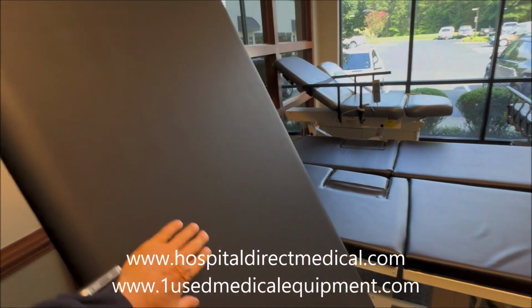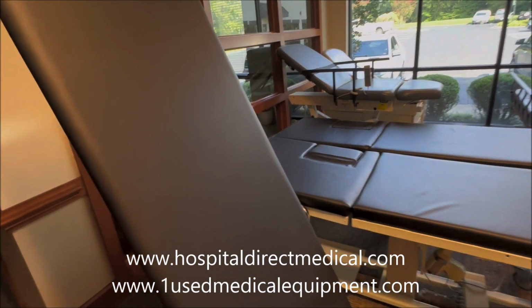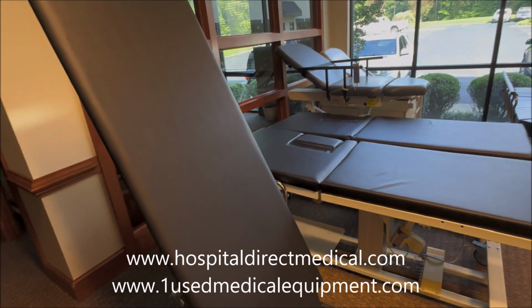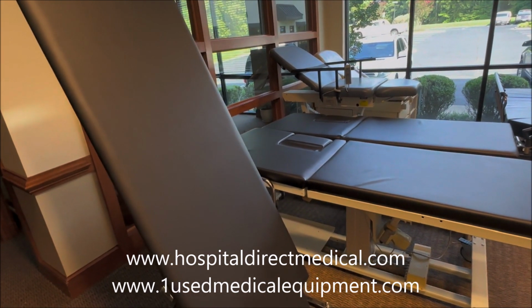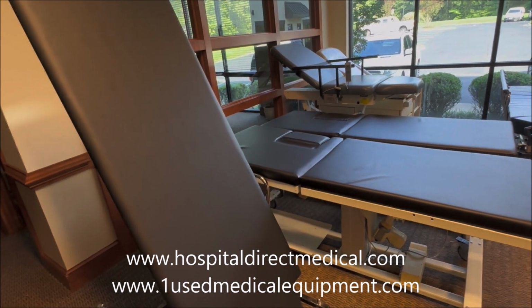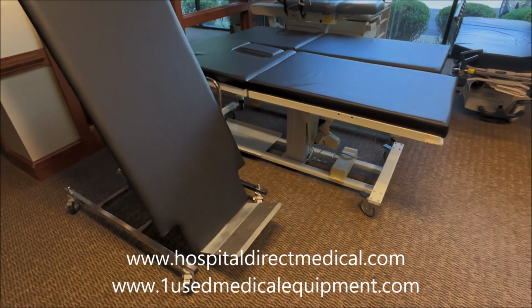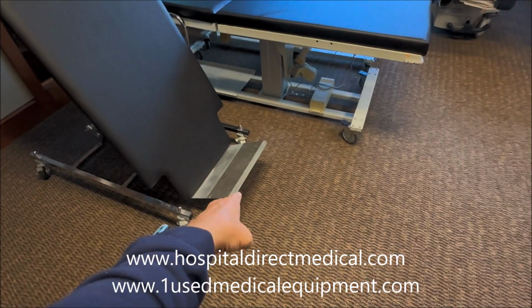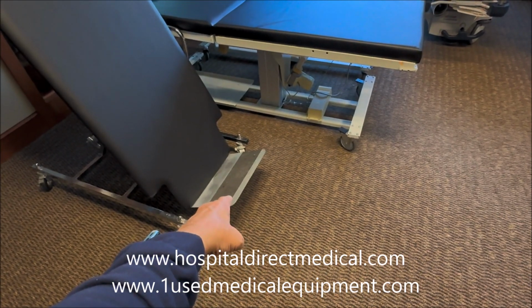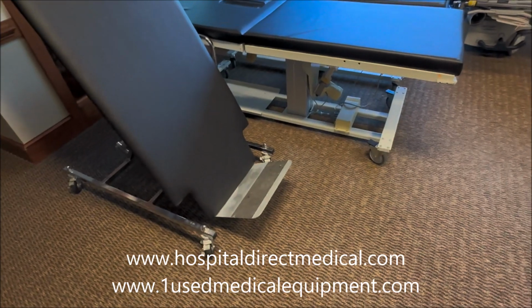The reason it's at this angle is that this angle, when a person is on it, is the ideal angle to get a probe into the carotid artery to check the carotid arteries in the neck and see how blood flow is and if there's any blockage and that type of thing. So the first thing you're going to notice about a vascular table, even if it's flat, is it's always normally going to have a headpiece or a footpiece, excuse me. So that's always going to be the first thing you look for.